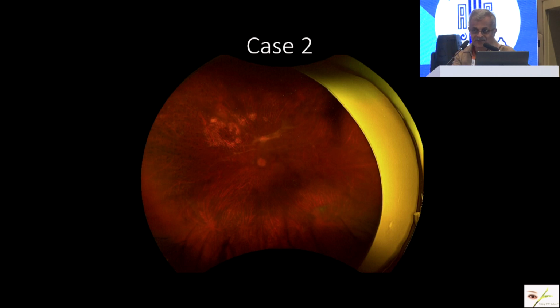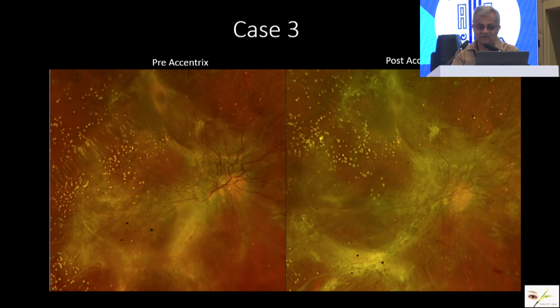So is this tool a must? Not necessarily, because you can see the same things on the table. There is something called intraoperative OCT also, but compared to intraoperative OCT, this swept source would have much better penetration. Because right now what Zeiss gives is intraoperative OCT, which is spectral domain. So I think this would be a better evaluation pre-operatively.